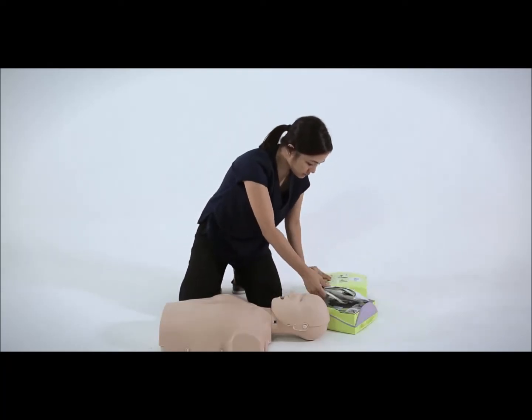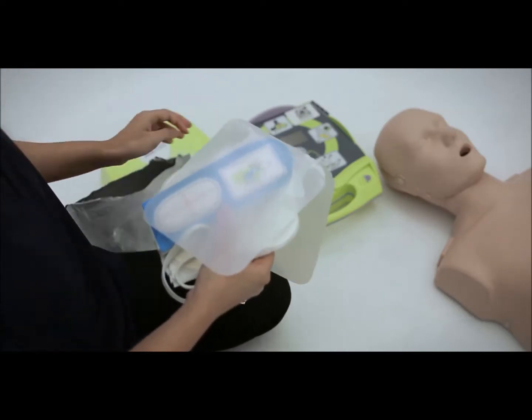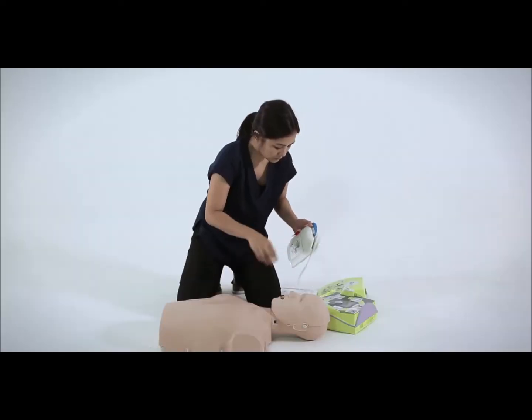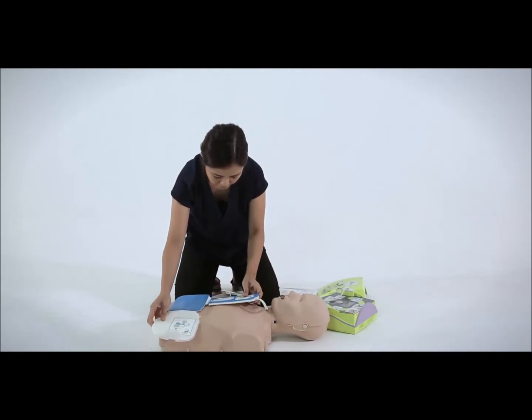Tear open the electrode pack and unfold the electrode pads. This is an electrode pad intended for adults. Some electrode pads, such as the one used here, are one-piece pads designed for easy placement. Using the plus sign on the CPR sensor to guide you, place the CPR sensor in the middle of the chest, in between the nipple line.